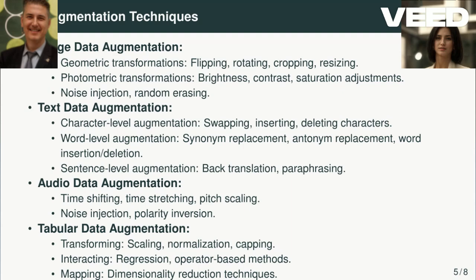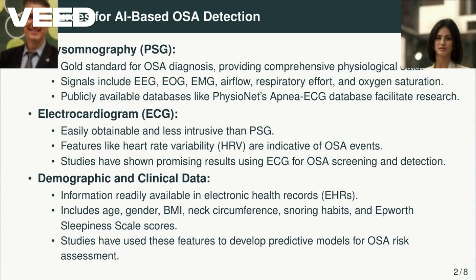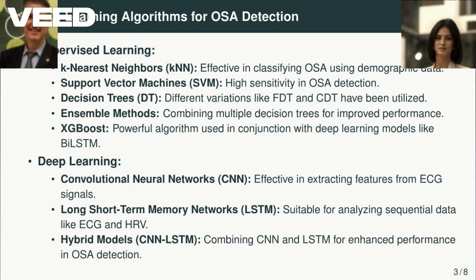And RNNs, those were the ones that were good at understanding things that happened in sequence, right? Yeah, like the different stages of sleep that you go through throughout the night. Okay. And an RNN can help pinpoint any patterns there that might indicate sleep apnea. So it's not just heart rate and breathing, it's also the sounds of your sleep and the way you cycle through sleep stages. Yeah. It's amazing how many different angles they're looking at this from.